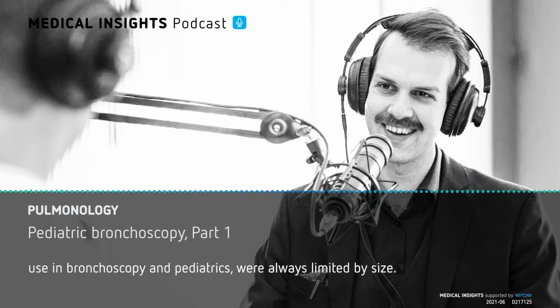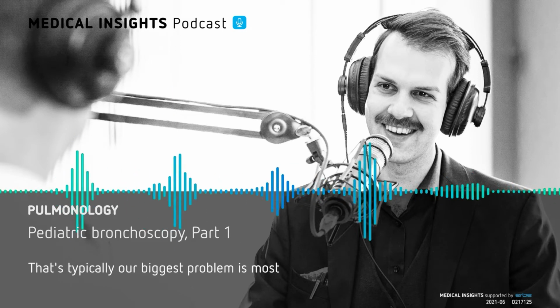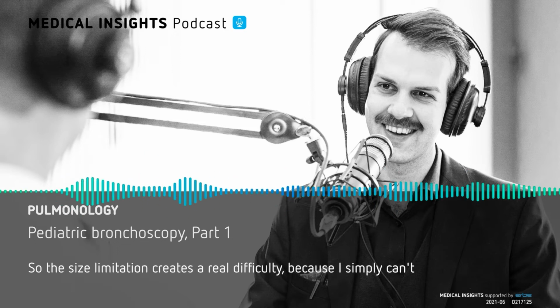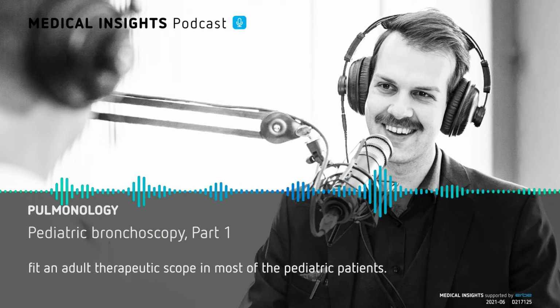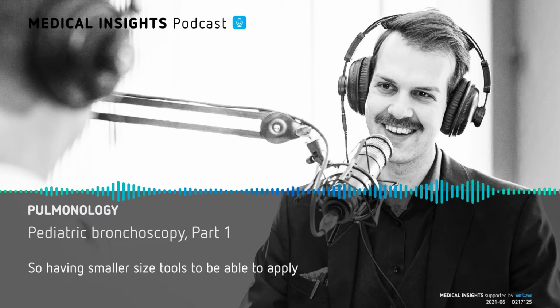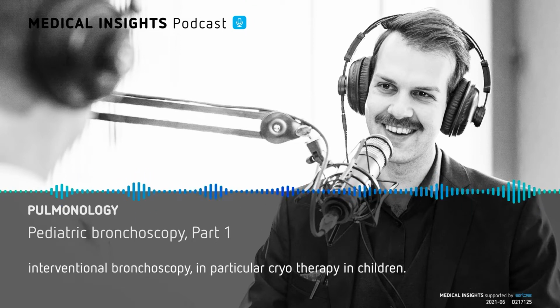Well, I think with any tool that has been for interventional use in bronchoscopy, in pediatrics, we're always limited by size. That's typically our biggest problem. Most tools are designed for adults and designed to go through adult scopes. So the size limitation creates a real difficulty because I simply can't fit an adult therapeutic scope in most of the pediatric patients. So having smaller size tools to be able to apply would be very useful in terms of being able to apply interventional bronchoscopy and in particular cryotherapy in children.